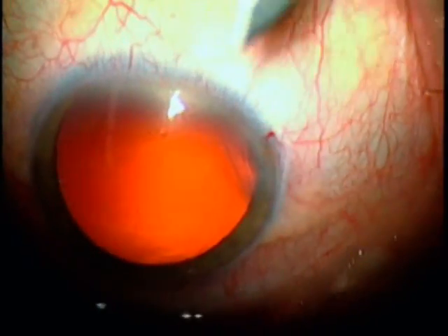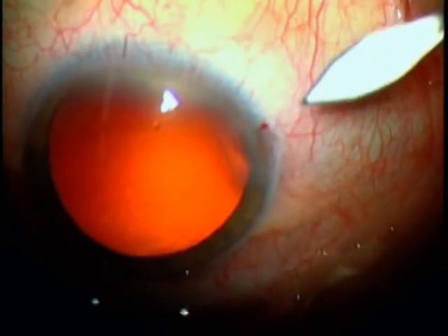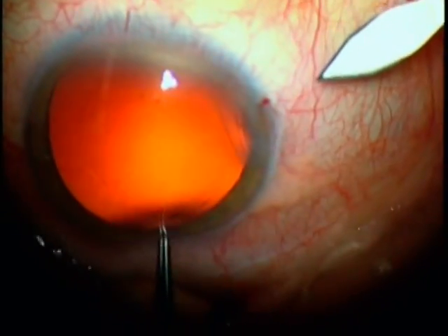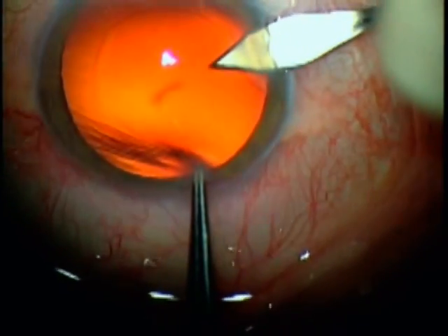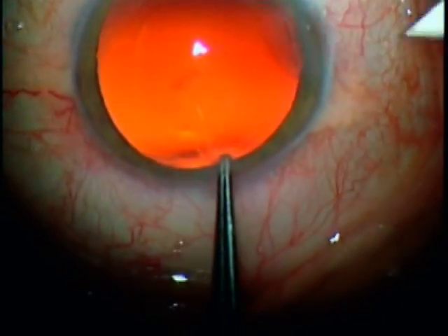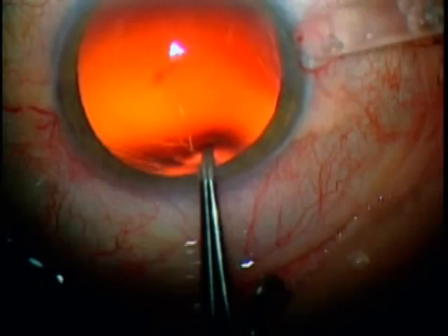Hi, my name is Dr. Timothy Peters, and I'm going to insert the Acreos lens through a 2.2mm incision. The surgery has been performed through a 1.8mm incision using the Stellaris Phacoemulsification Machine, and the lens is now enlarged to a 2.2mm fresh incision.